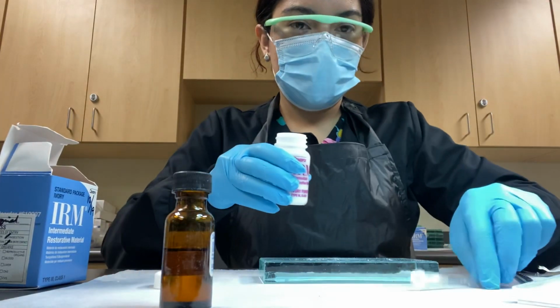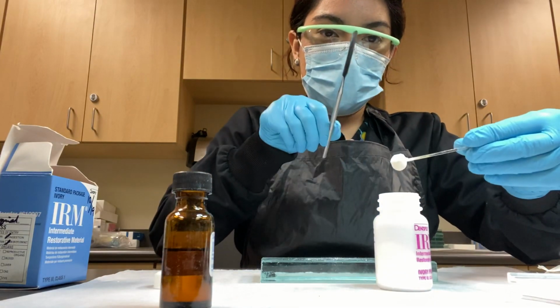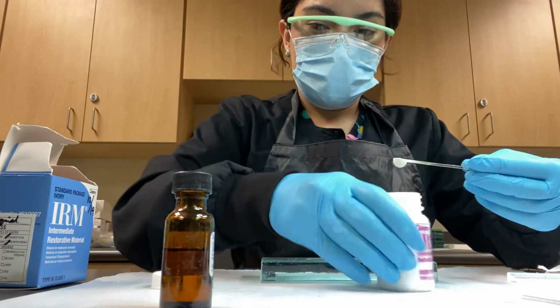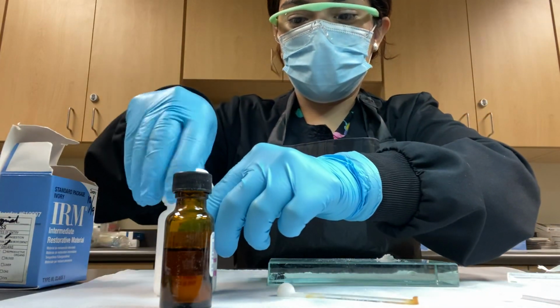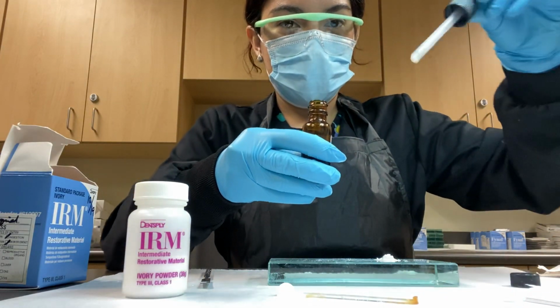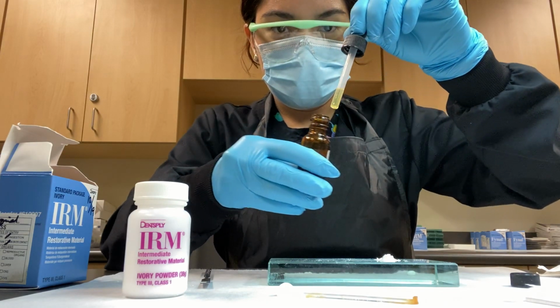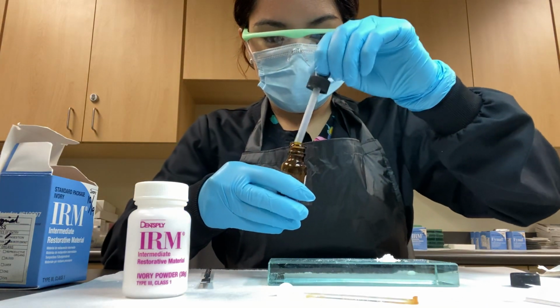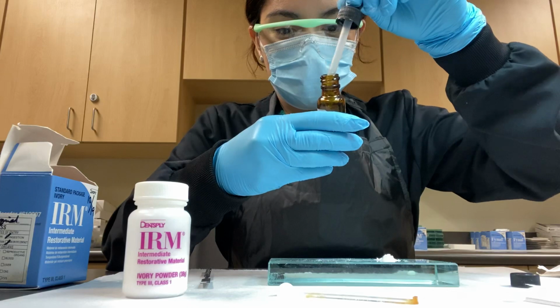Okay, so I will now begin to prep this, and I will even it out using a spatula. And close it. Now I'll get my dropper and put my 1 drop. Just making sure there's no more excess in here.